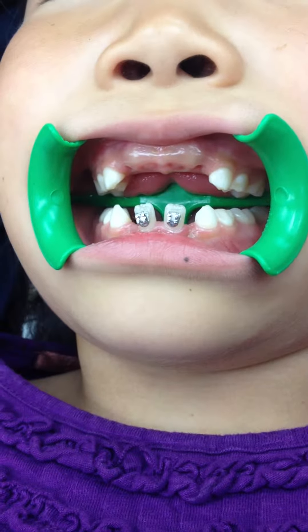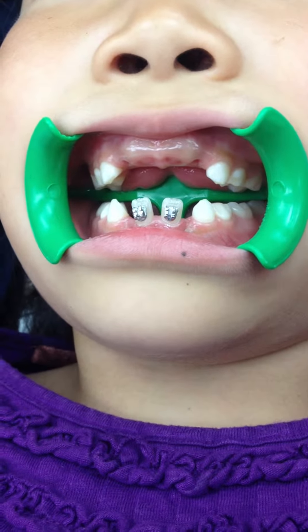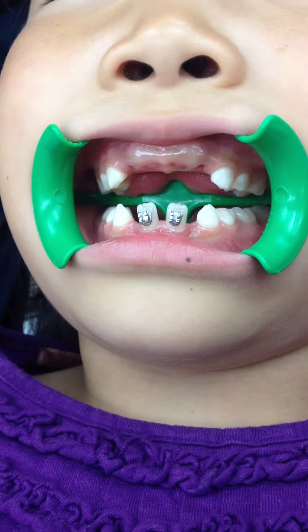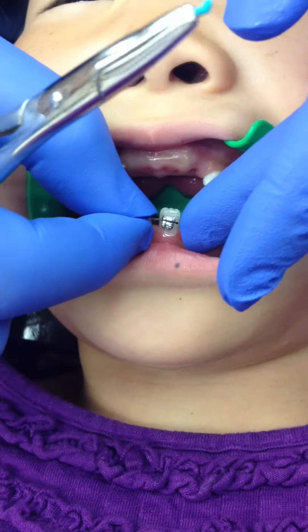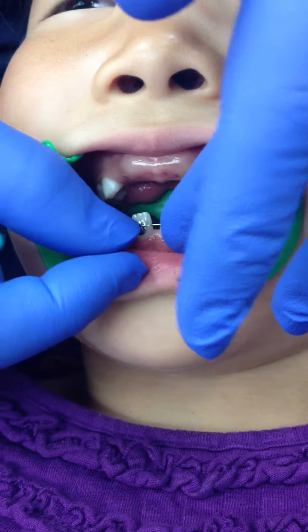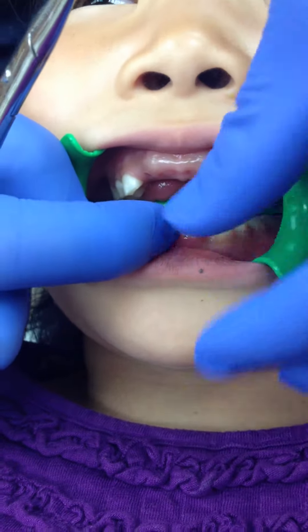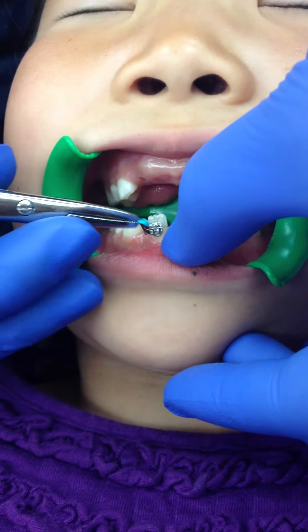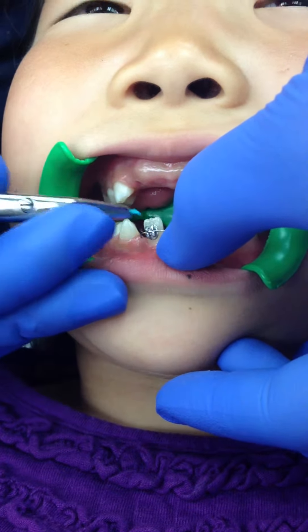This is Dr. Scott Chong, and now I'm going to demonstrate on my daughter Jocelyn what it looks like when you get your first wire and your colors. People say all the time that we're going to tighten your braces, but that's not actually true. We don't tighten them. What we do is we activate the wires, and the way they're activated is by holding the wire in place with these little colored rings.